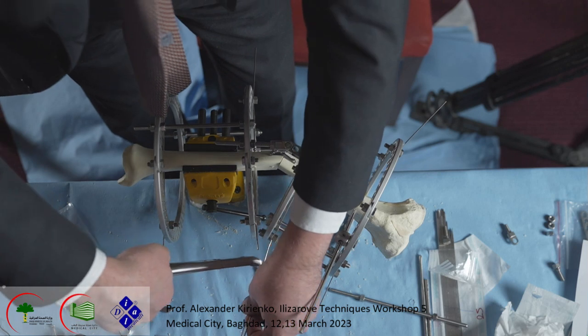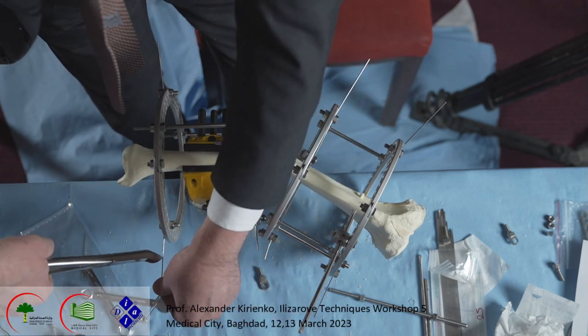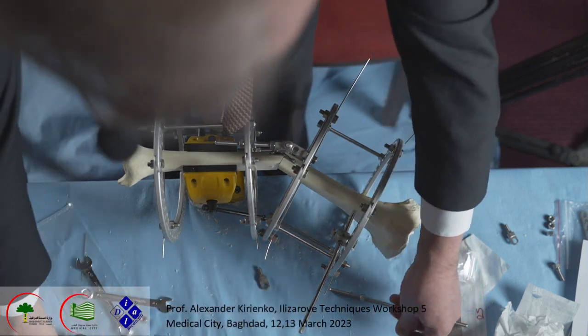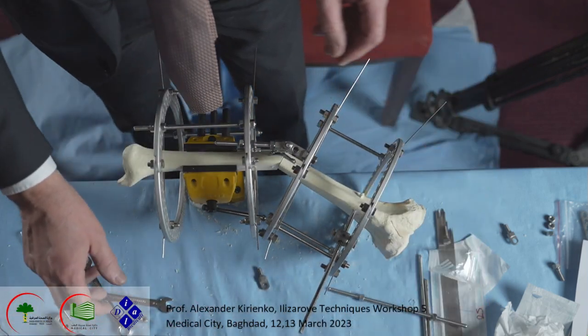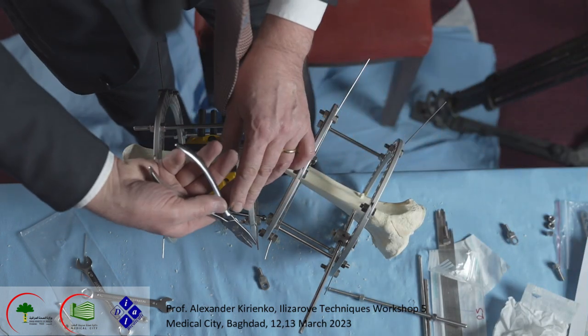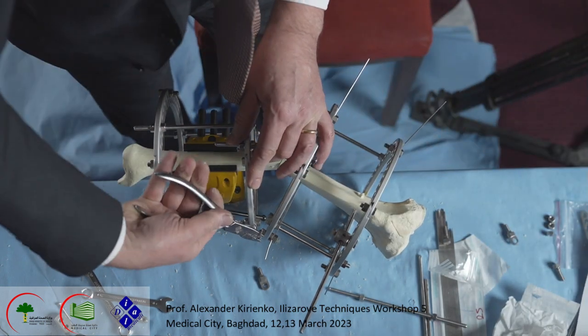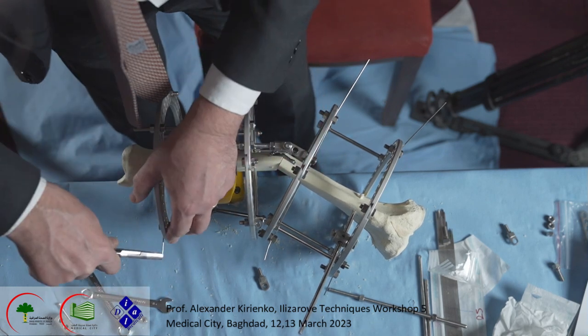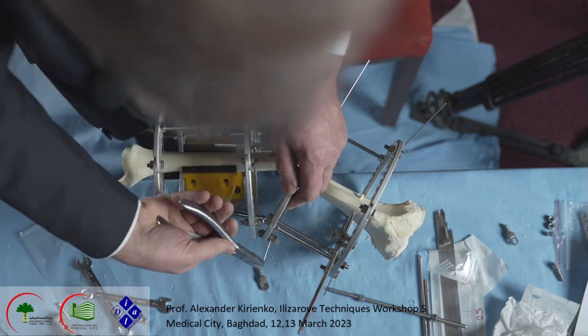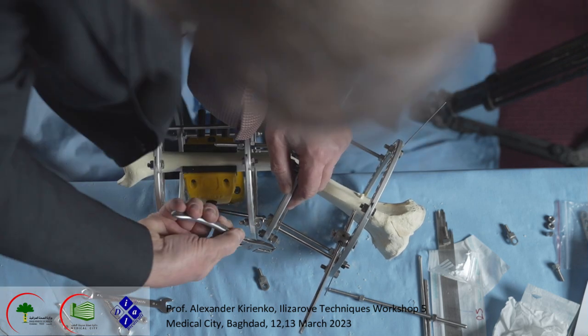I cut this because it's dangerous. These tips, better to cut them always in the workshop. Okay, we bend this wire. Now 4 wires just maintain the good realignment. We bend them.